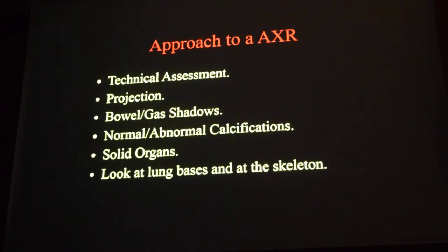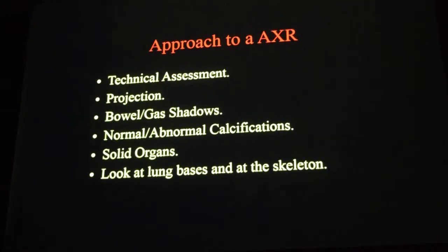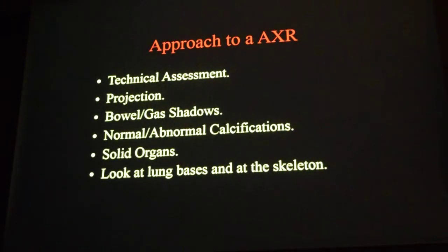So you do an erect film, or a decubitus film if the patient is unable to stand up or cannot sit. You make the side where you think the problem is face up. For example, if it's a duodenal perforation, you make the right side up, so you do a left decubitus. You make the patient lie for 10 minutes in the left down position with the right side up. If there is air, the air would rise, and since this side is up, you'll see that air lining along the abdominal wall. I'll show you examples of this.